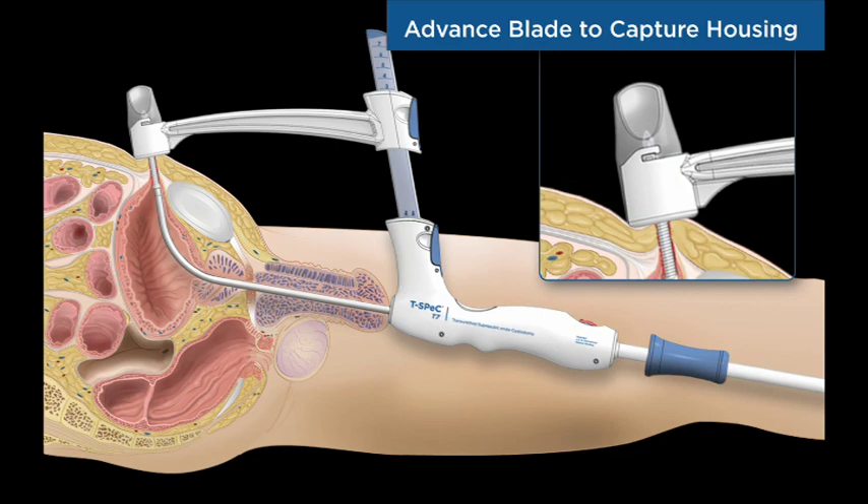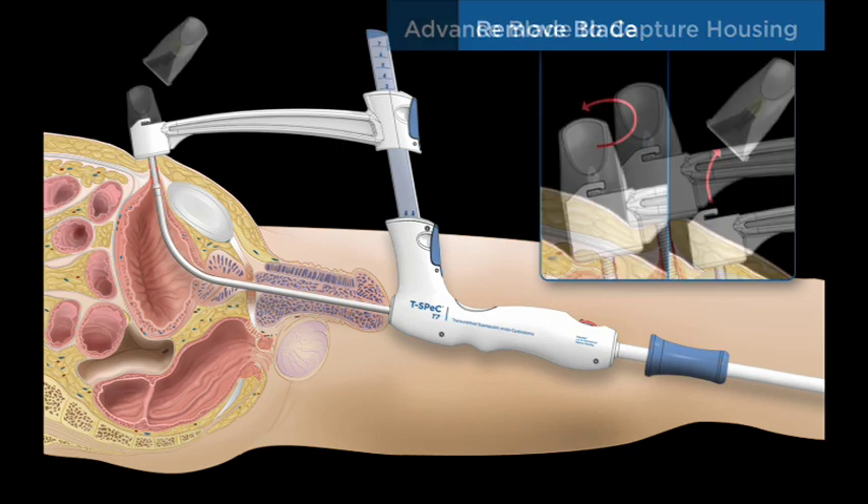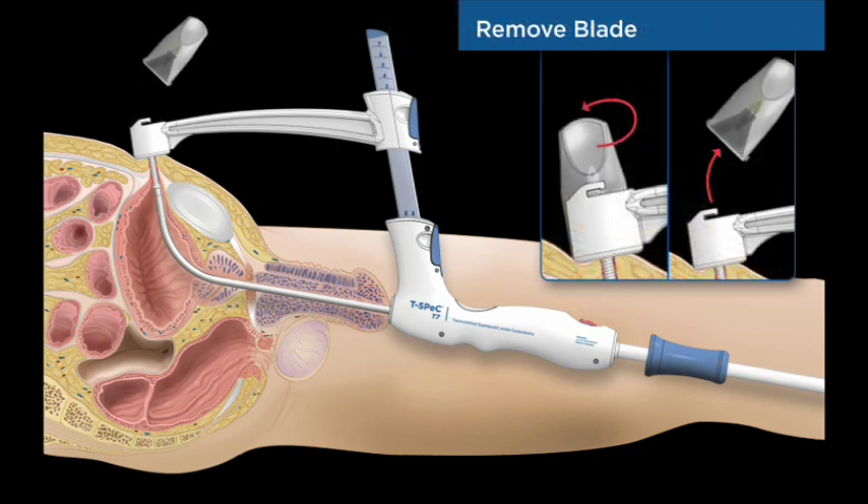The rear handle is advanced until the cutting blade is embedded in the capture housing. The capture housing is precisely positioned over the patient's abdomen to receive the cutting blade. The cutting blade and capture housing are removed with a simple twisting motion, leaving only the catheter bayonet connection and coil at the abdomen surface.